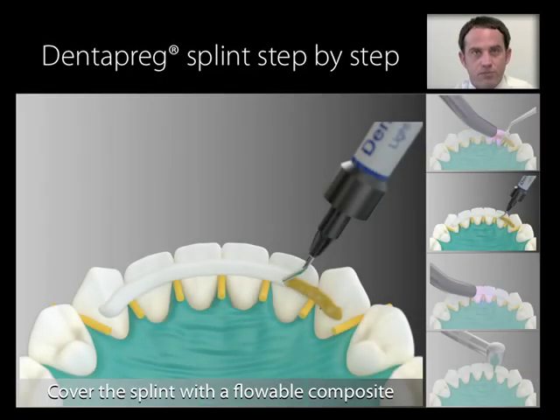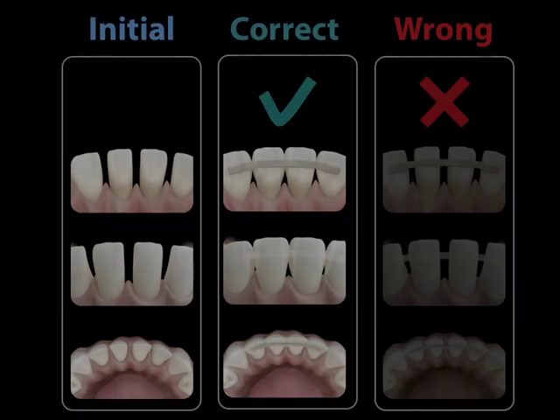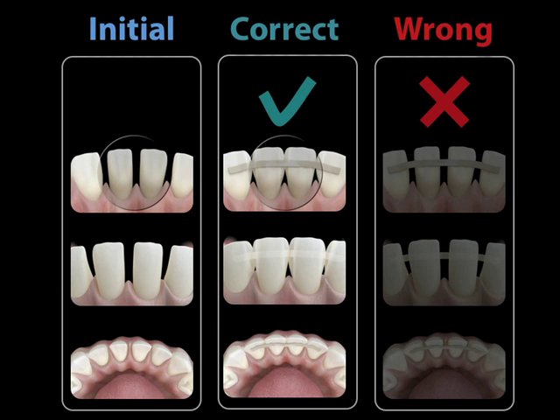Cover the entire surface of the splint with a layer of flowable composite. Keep in mind that this layer serves as a masking layer and provides the splint its final color, but it also contributes to the final rigidity of the splint. A more viscous and thicker layer of composite creates a more rigid splint. Using a flowable composite gives you a splint allowing physiological movement of the teeth, while using a more viscous composite gives you a rigid splint appropriate in specific situations in trauma treatment. If there are interproximal contacts missing, reconstruct them by extending the width of the crown with an appropriate veneering composite.